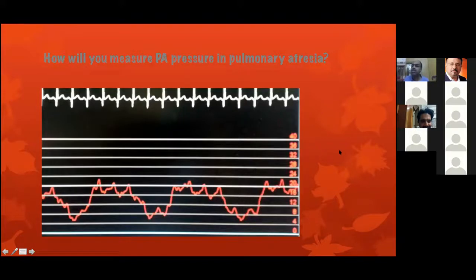There is a question, when there is increased respiratory variation like in Down syndrome with upper airway abnormality, won't taking the end diastolic pressure in expiration alone cause an abnormally high pressure, and will it reflect the true end diastolic pressure? All the end diastolic pressures are taken to prognosticate that particular patient. So the highest pressure is taken in order to assess the worst case situation.